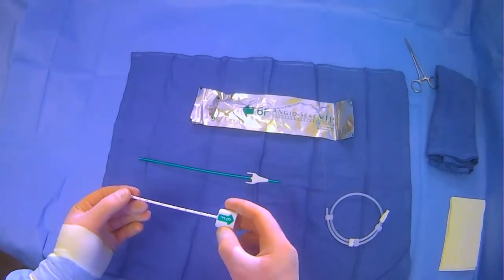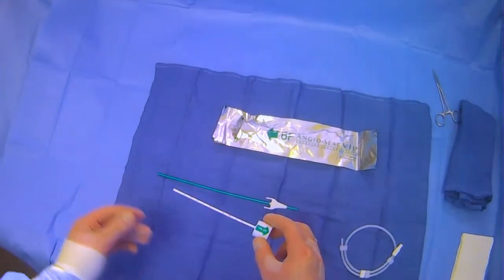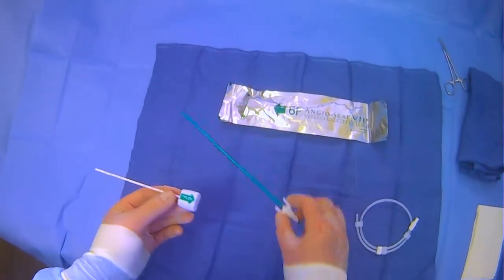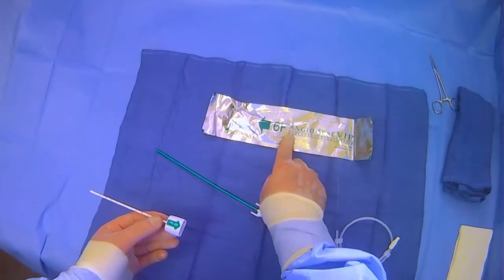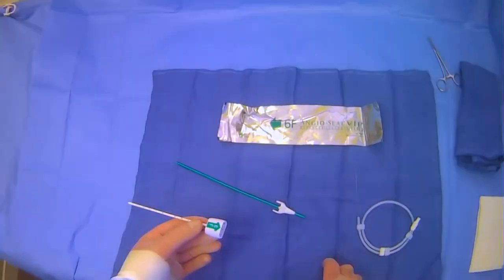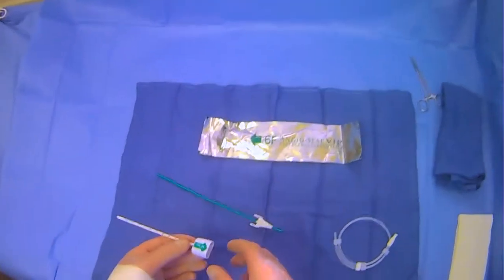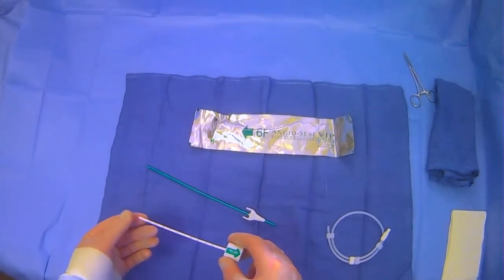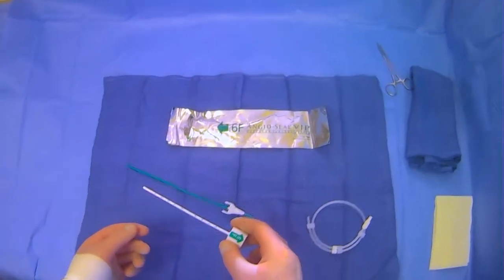This is a 6 French size. What is included in the kit is the introducer, which has this inner stylet, the actual AngioSeal device, and then a wire for putting on the introducer and taking off your arterial access sheath.